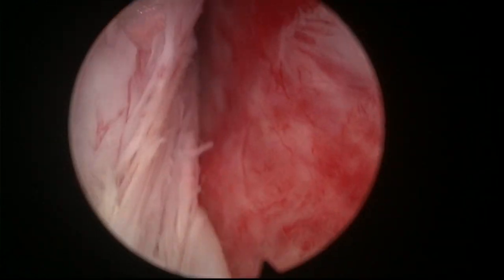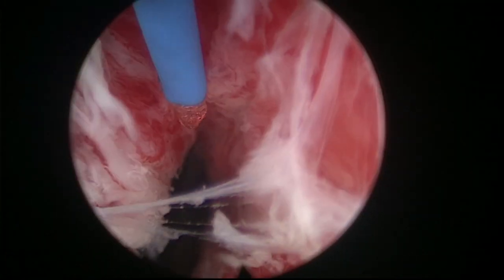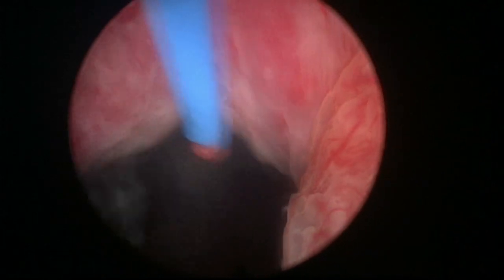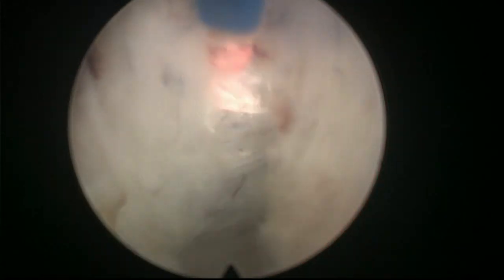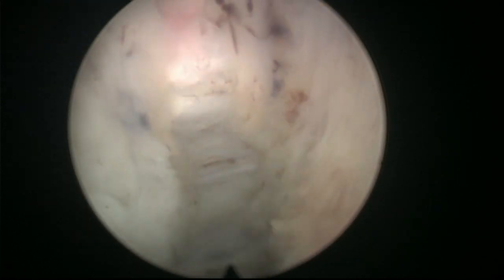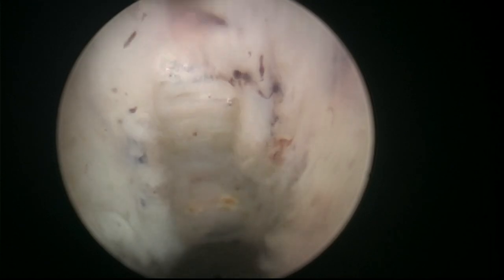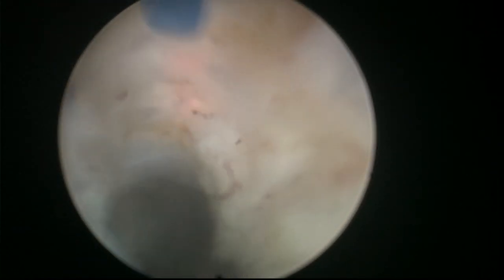If you remember, we already marked at 12 o'clock. This is the 12 o'clock mark — here is the white line from the other side. Now we perfectly know where 12 o'clock is and where the limit of the sphincter is, so we're not going to make mistakes there. I'm going to come here, under the 12 o'clock region, and make a small cut that I'll bring towards my limit. I'll do this incision again until we see some capsular fibers. Anteriorly, they are a little bit more easy to distinguish — you can see the aspect of the fibers crossing, usually quite bright and shiny.